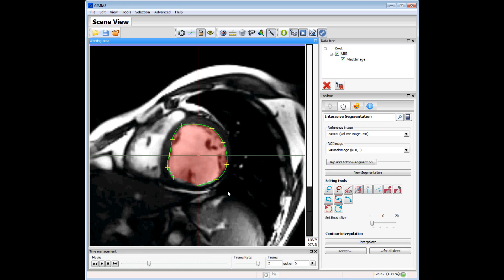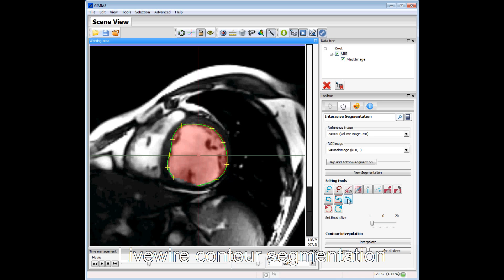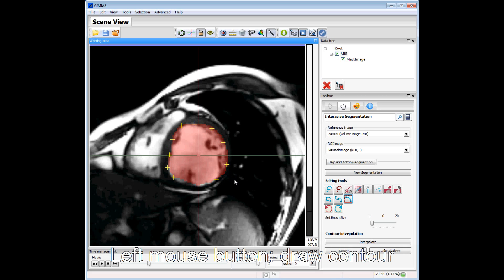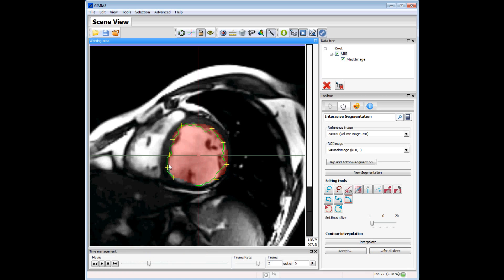We paint the inner zone. In this case the left ventricle boundary is smoother — this method is better for this kind of region. We can also use another kind of tool called the live wire. We click on the tool, click the left mouse button over the image, and this is the result of the live wire segmentation.